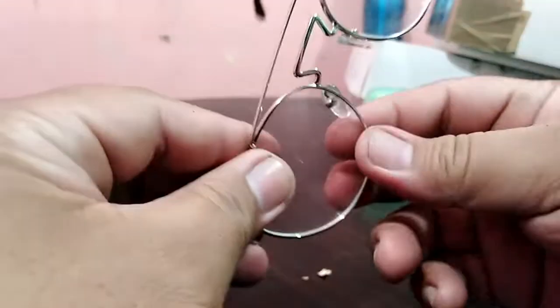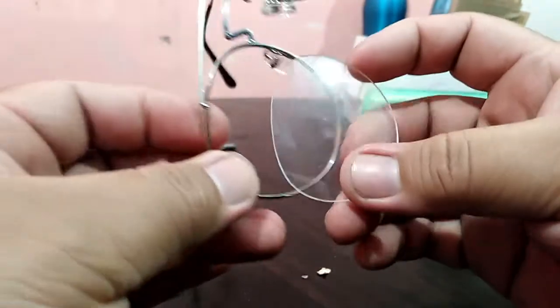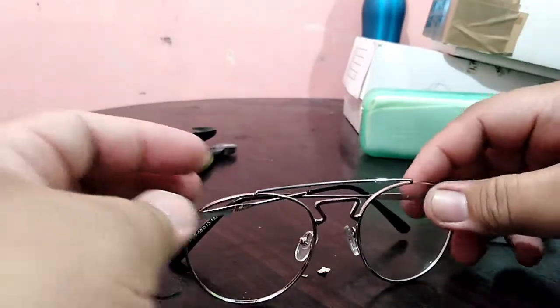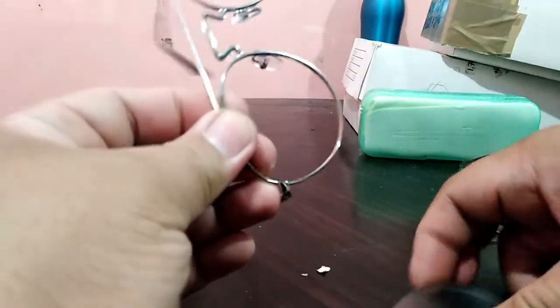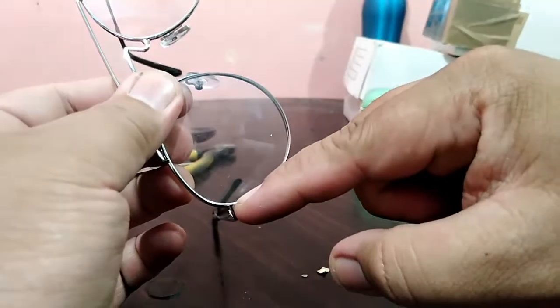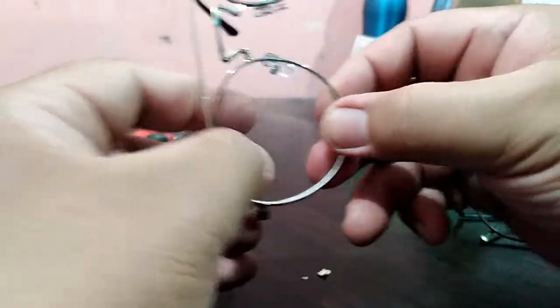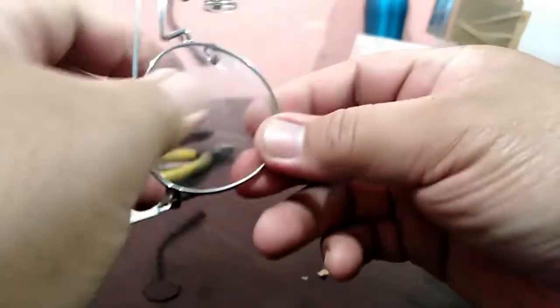By following this video, you can insert your lens without bringing the glasses to the optical shop. It's very simple — from nasal to temple side, push, and then hit the lower part of the lens in.